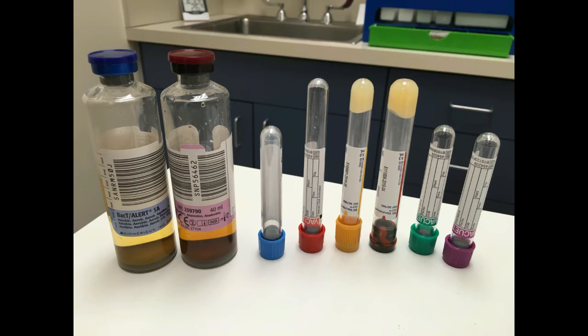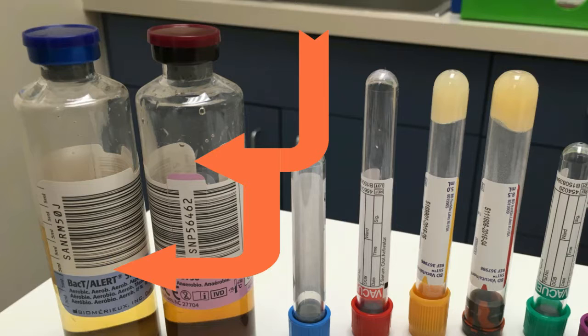Blood cultures are ordered as a set of 2 bottles, aerobic and anaerobic. Aerobic requires the presence of oxygen, and anaerobic does not, for certain organisms to grow. These bottles are incubated up to 5 days. It is a test to culture bacteria or fungi that may lead to an infection in the blood.